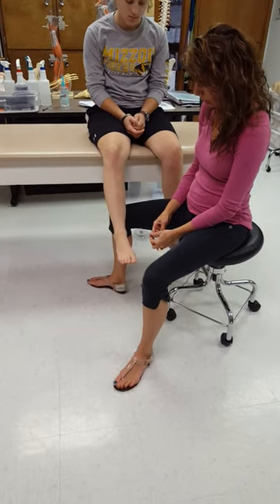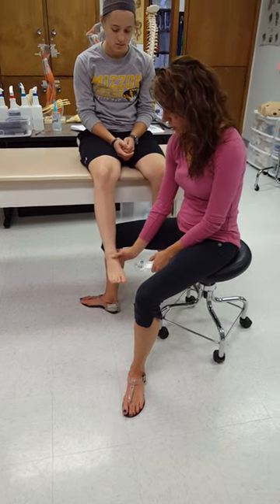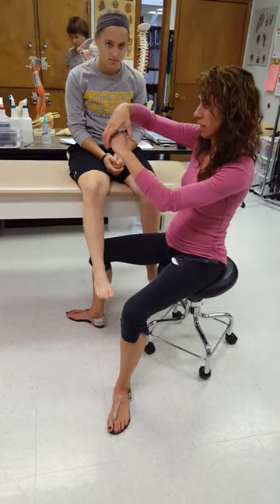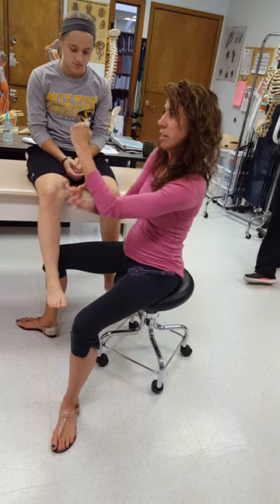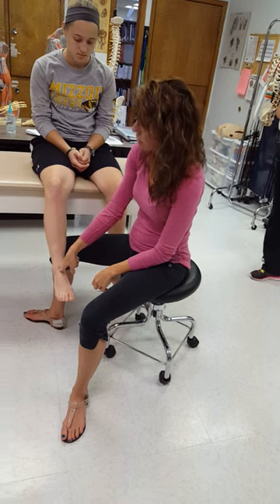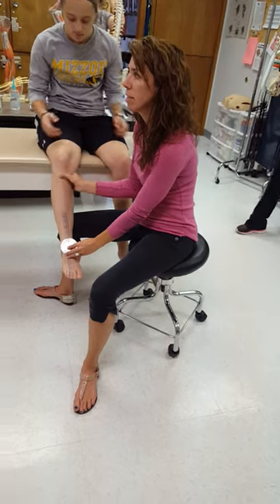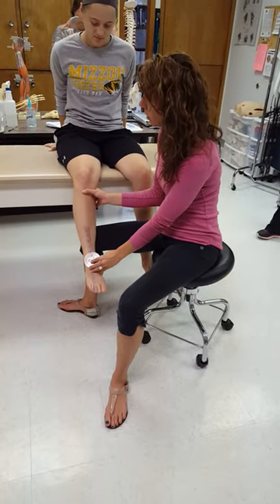Have the patient sitting, and you can crouch down or sit on a stool. You're going to find the talus bone, which is going to be between your malleoli — the malleoli make a concave surface and the talus sits inside there. Find those malleoli and put your finger right in between them — that's your fulcrum. The stationary arm is the tibial crest, and you use the tibial tuberosity, which is a bony prominence right in the front just below the patella.